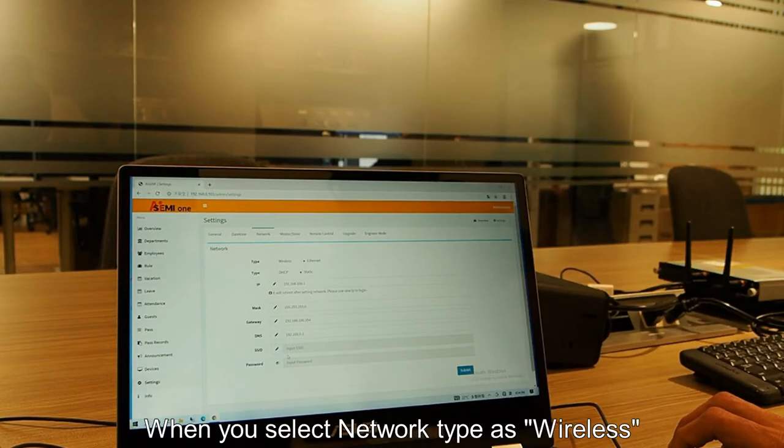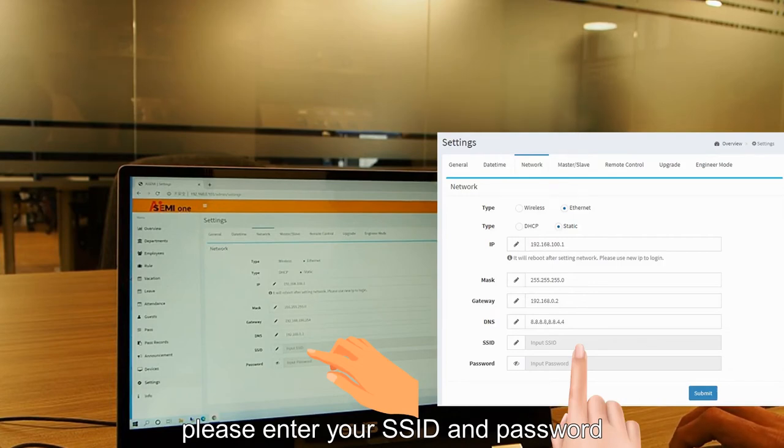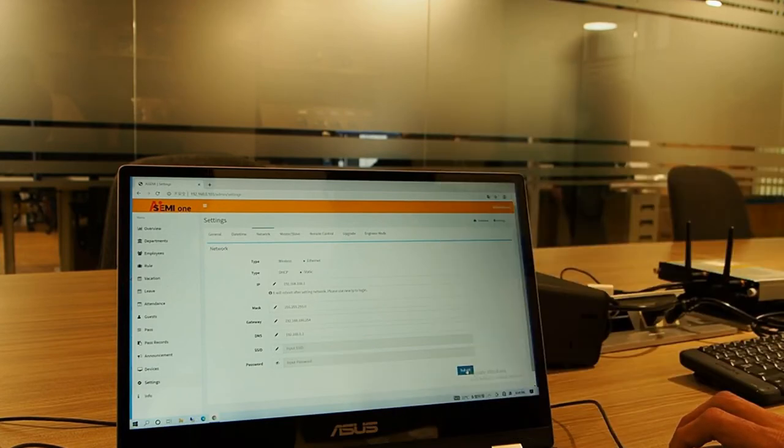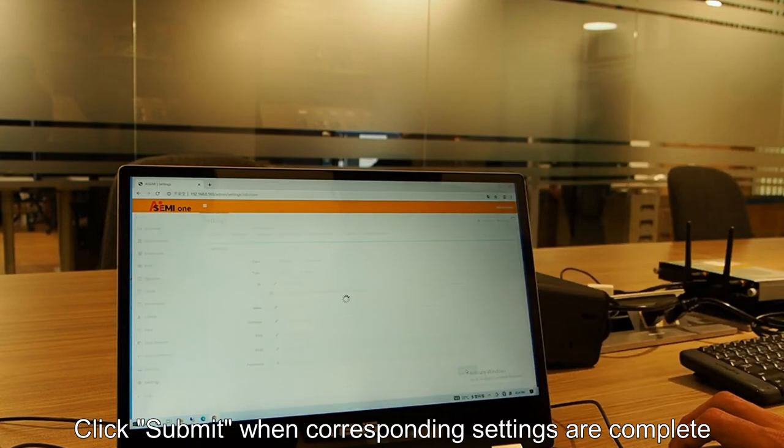When you select network type as wireless, please enter your SSID and password. Click submit when corresponding settings are complete.